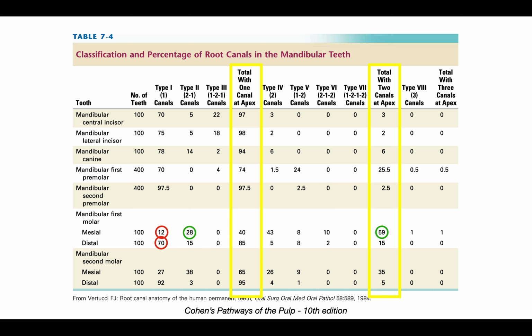And so what I would encourage you to do is on your in stroke, proceed apically. And then on your outstroke, I would encourage you to brush the walls, usually in a buccolingual orientation, so that you can debride that oval-shaped canal with your circular instrument. If you just peck in and out, in and out, in and out, you're not going to fully debride that oval-shaped root canal.